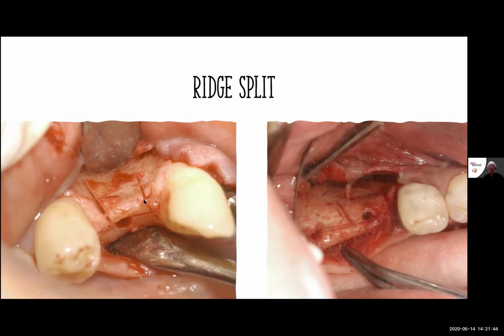It is one that I suggest that with the releasing incisions of bone and the coronal incision that's made, that these two corners meet. In other words, that you make the incision through the bone and the releasing incisions all the way from the coronal portion down, so that this segment of the bone frees up completely. And if this whole segment of the bone is freed up completely, then that's going to allow that to expand and to move.